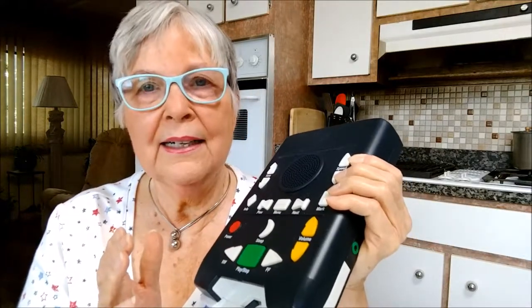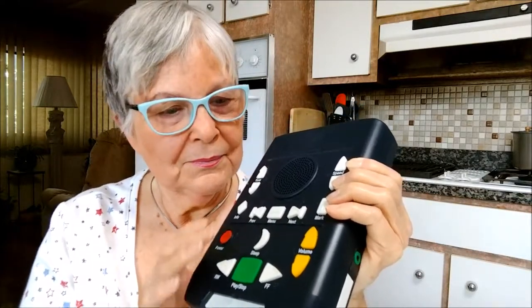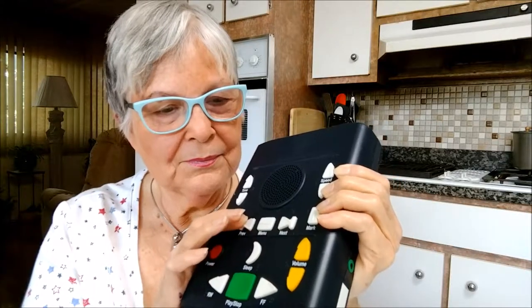To start or stop playing a book, use the large play/stop button. There's also a sleep button: pressing it once will play 15 minutes of the book and then stop the machine. Pressing it twice will play the book for 30 minutes, three times for 45 minutes.